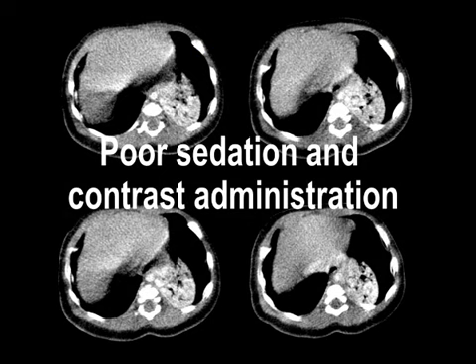Another example: a child had a chest x-ray showing a left lower lobe mass. One of the things in kids we think about as a congenital abnormality is called a sequestration. It's curable, they take it out. It's a congenital thing that has some abnormal blood vessels that come from the aorta and go to this mass. But this scan had the same report as the chest x-ray, which said left lower lobe opacity. We were not able to identify blood vessels. We weren't able to provide any better information because of poor sedation and poor contrast administration.